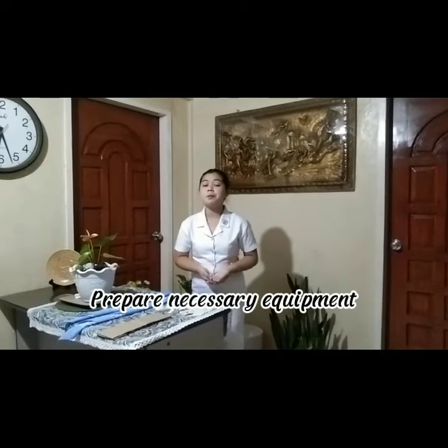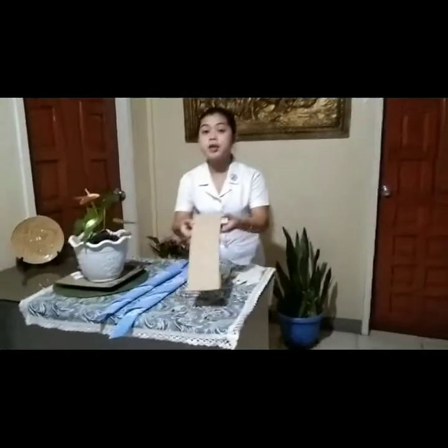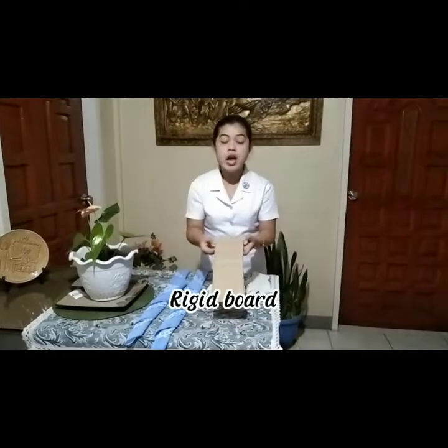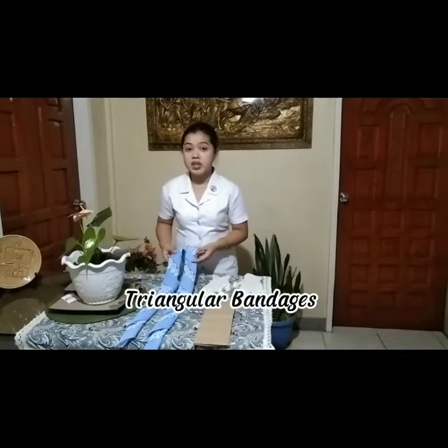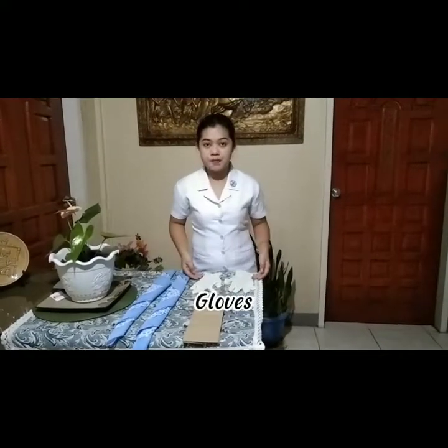Step 1. Prepare necessary equipment. We need to prepare a rigid board, at least 2 triangular bandages, or any long cloth that can serve the purpose. Take note also that we need to prepare gloves in order to prevent blood getting on our skin. As you can see, we already prepared a rigid board, but if you don't have a rigid board, you can use a pillow or notebook. We also have 2 triangular bandages, and of course our gloves.